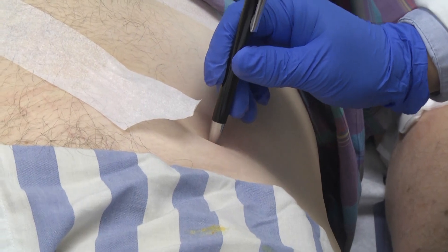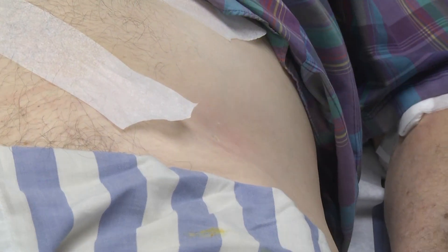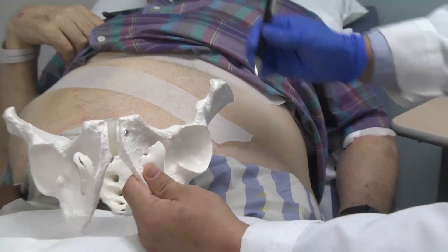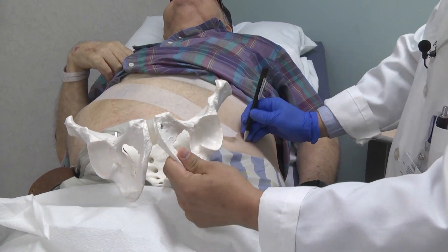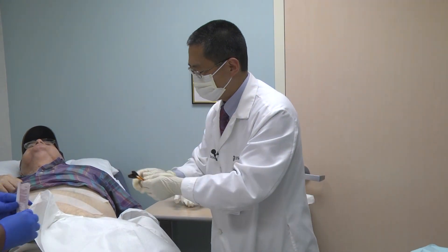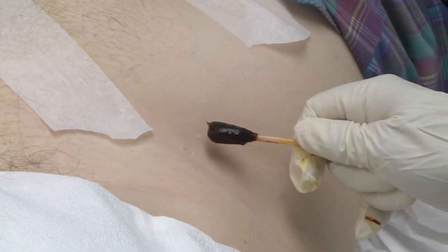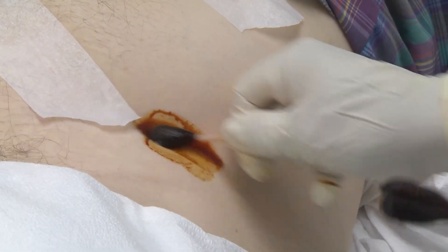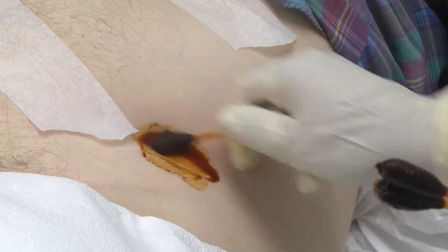Is it hurting? No. Not so bad. Good. Got it. The first step is to clean thoroughly — see this angle here. Rub very nicely so the germs will not get inside.